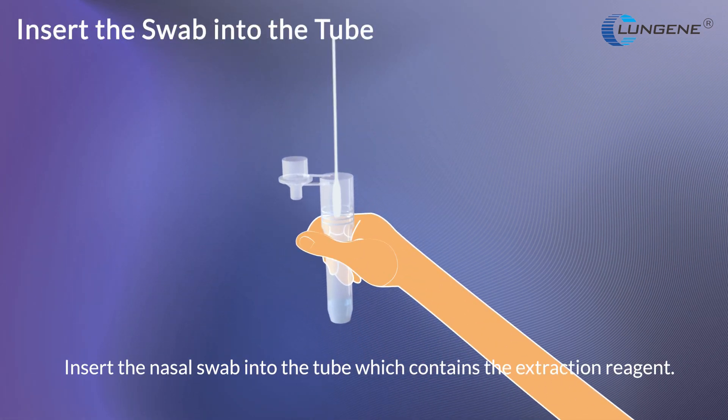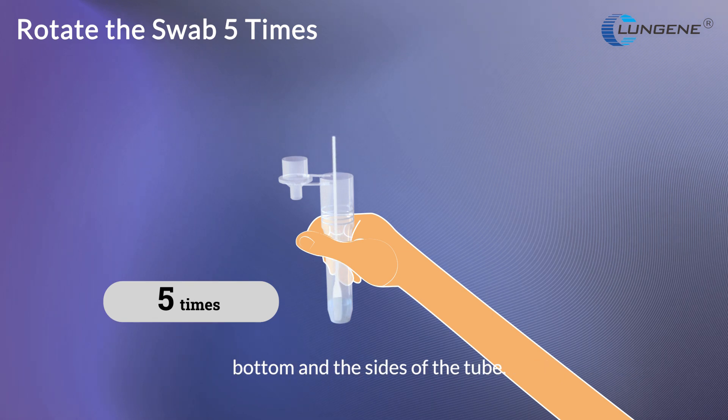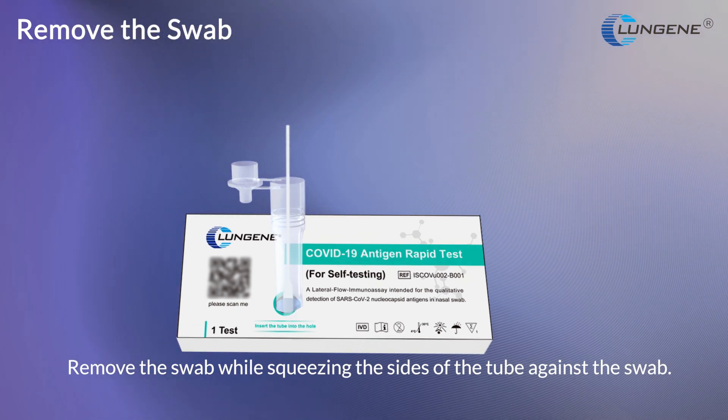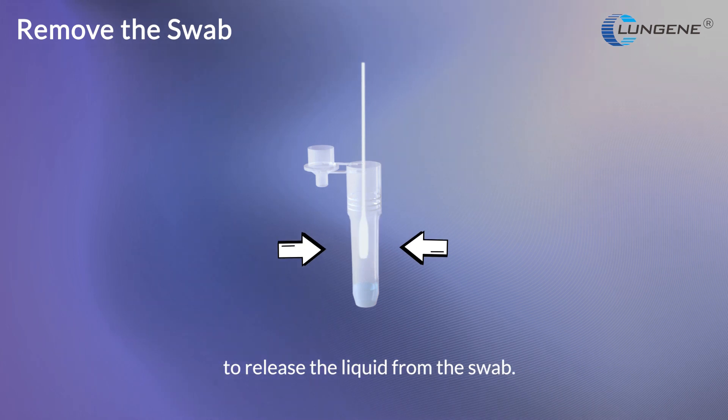Insert the nasal swab into the tube which contains the extraction reagent. Rotate the swab at least 5 times while pressing the swab tip against the bottom and sides of the tube. Let the tip of the swab soak in the tube for 1 minute. Remove the swab while squeezing the sides of the tube against the swab to release the liquid.